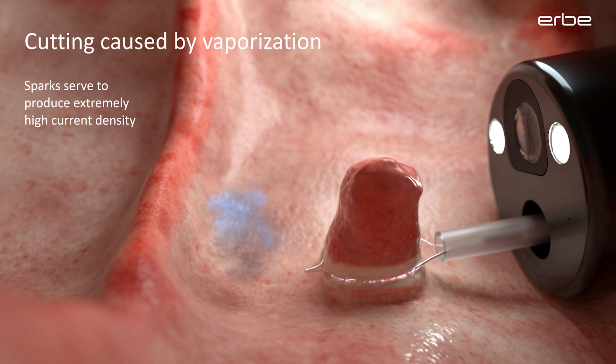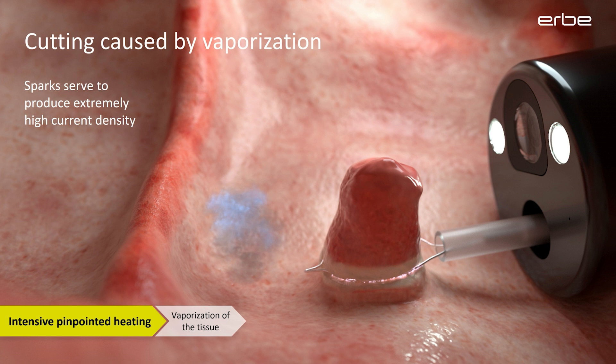When you activate the instrument, you can often observe a spark formation between the electrode and the tissue. These sparks are also electrical conductors, like the electrode, but they are much thinner. Therefore, they can develop an extremely high current density. This is how the temperature can become hot enough to vaporize the tissue at the point of contact. This explains why spark formation is essential and actually required for electrosurgical cutting.